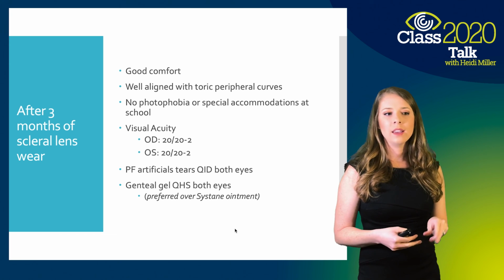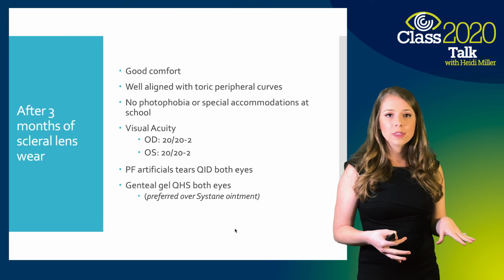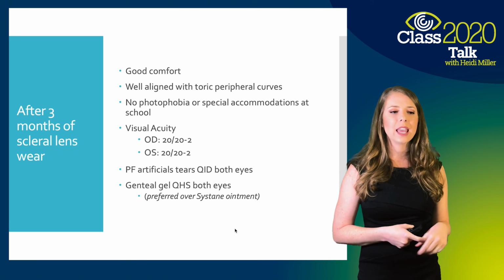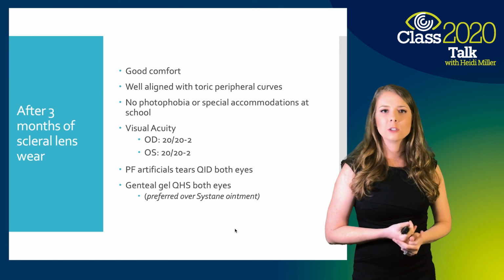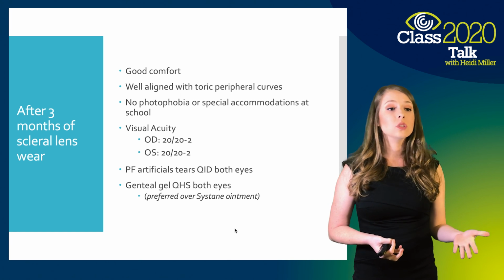20/20 in the right eye and left eye, -2. And she was still doing the preservative-free artificial tears 4 times a day in both eyes. I switched her over to Genteal gel at night just because they had a complaint that they didn't really like the ointment. It was making her vision blurry and goopy. So once they tried the Genteal gel, they liked it a lot better. But you can see how the scleral lenses made a huge difference.